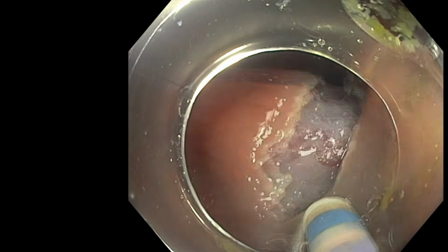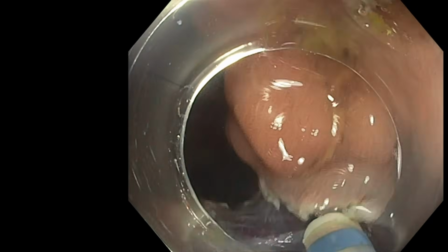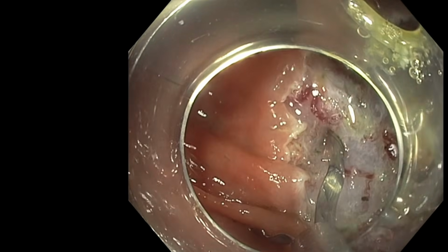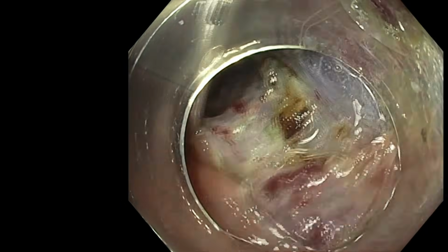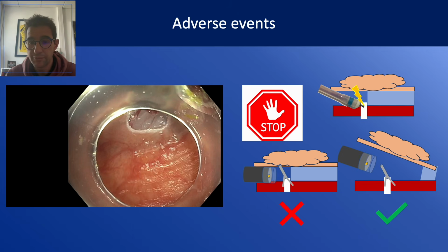You should achieve your incision, do your trimming, dissect a little in order to open the space, and when the holes are far from the area you want to dissect, you have to put a clip to close the area of perforation without preventing the end of your resection. So please be aware that perforation will come and you should be prepared, trying to open the space before closing the defect, because if you close before doing ESD, it will be very difficult to achieve the resection.